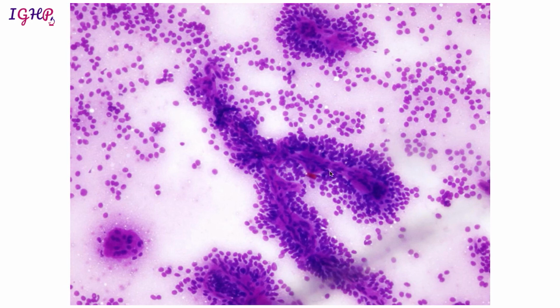Now, in addition, in these papilloid fragments, we could also make out that there is a capillary cluster around which these cells are arranged. So there is an endothelial fragment around which these similar looking cells are arranged. So in the absence of mucinous background and the presence of these monotonous appearing cells together with papilloid fragments, this would fit the features of solid pseudopapillary neoplasm. And for this SPEN, we are going to ask the clinician to also make a cell block, because we can do further IHCs on this lesion and confirm the diagnosis.